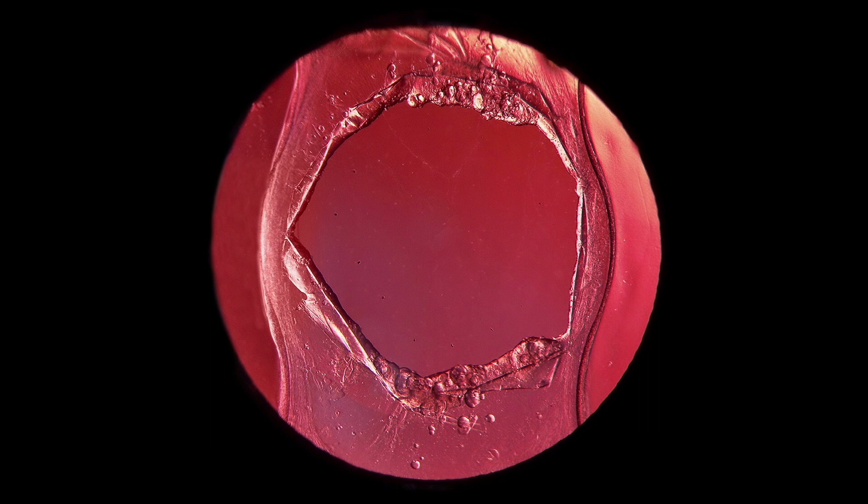An alternative approach is the circular or can opener technique, where a round opening in the posterior capsule is created. If pits are created, they usually are not a disturbance because they are away from the optical center and visual axis.